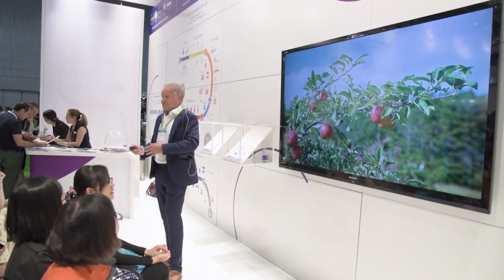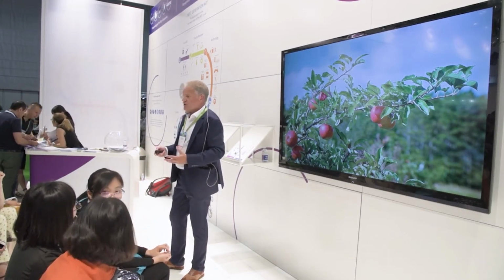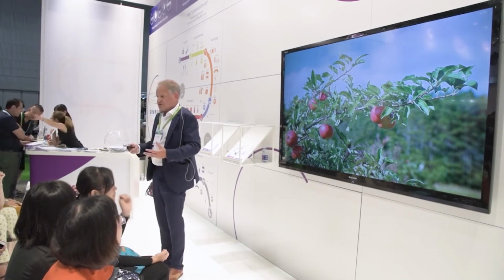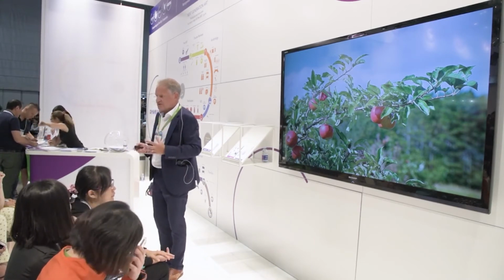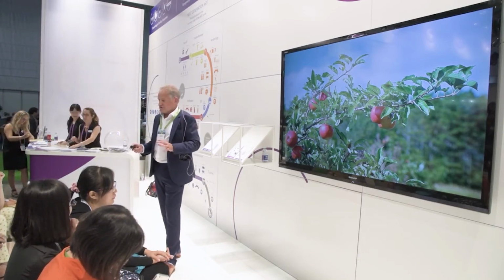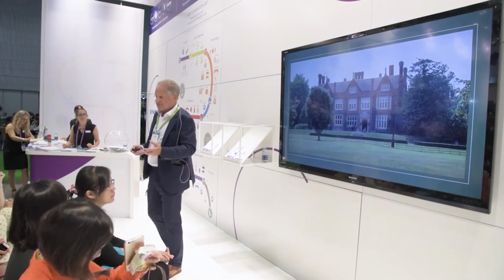Now obviously, if you've only got a few follicles in a poor prognosis patient, then it's probably in the patient's interest that you do flush. But if that patient had a good response with good follicular growth, with a cohort of good sized follicles that are not too big and not too small, then there is really no evidence to suggest that you should flush that follicle or curette it even.